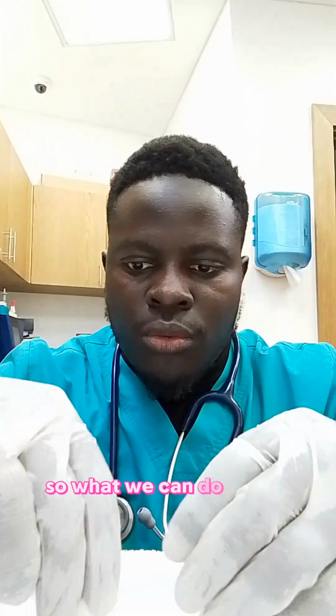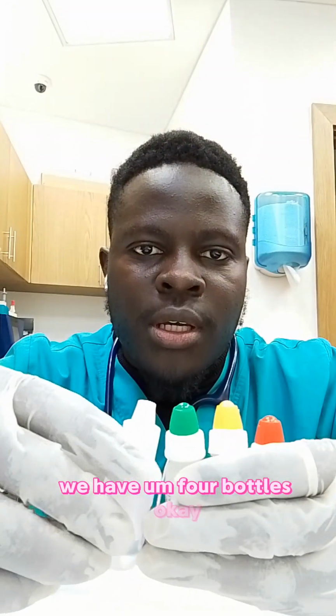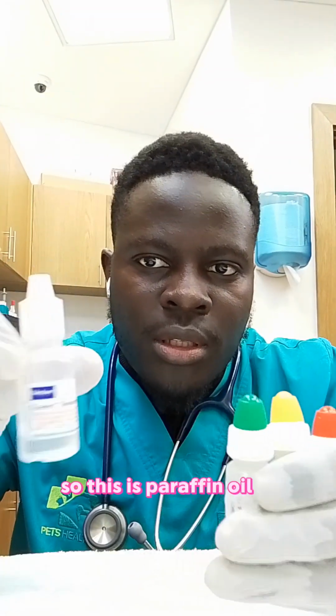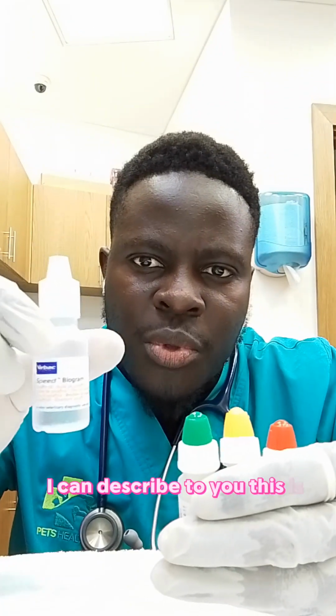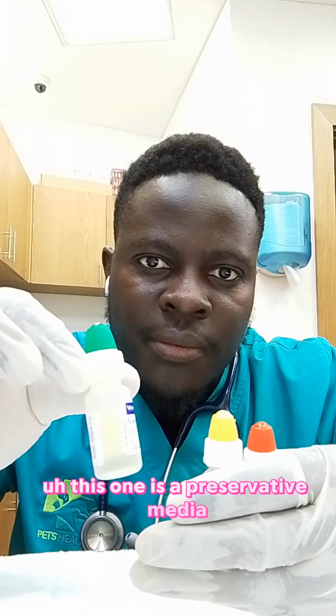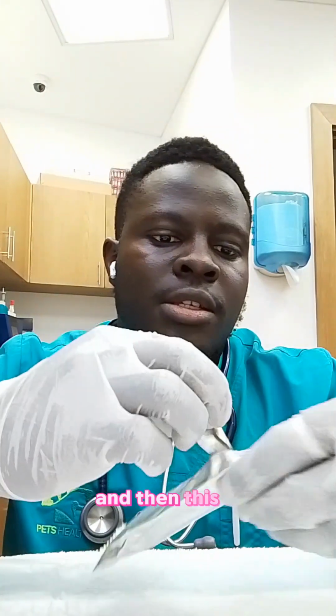So what we can do here, we have four bottles. This is paraffin oil. The words are not clear, but I can describe to you. This is paraffin oil. This one is a preservative media. This one is a culture media. This one is a staphylococcus supplement.